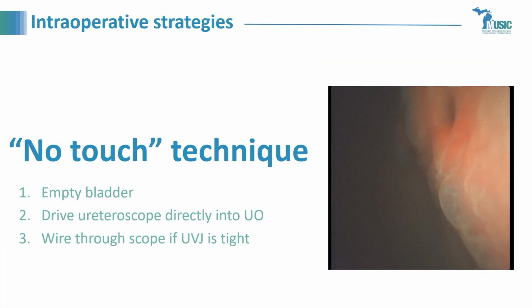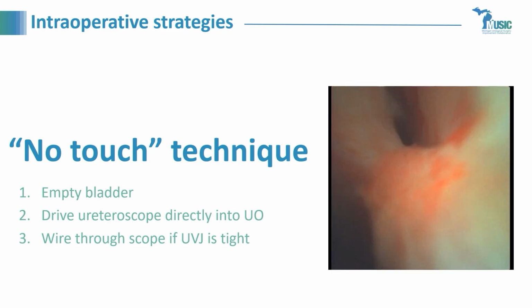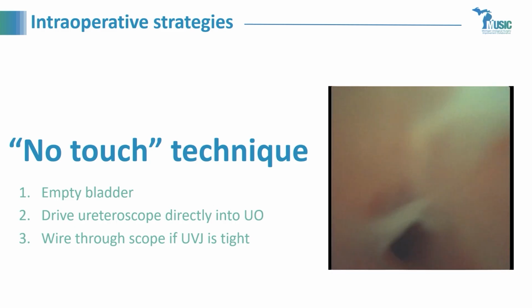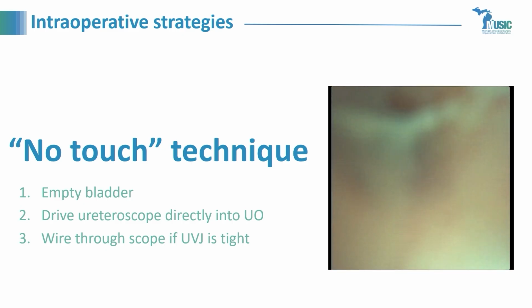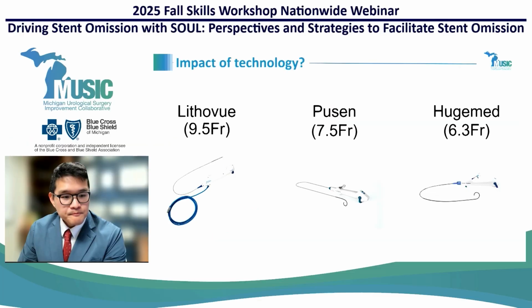No touch, this is something I was doing in training, but I think this has certainly helped me get away, or at least mentally get away with feeling better about not putting in stents in patients, especially when you can navigate the ureter pretty easily just with one pass with a ureteroscope.